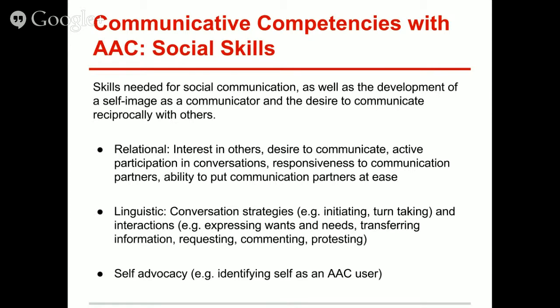Social competency skills are essential for communication with real people in real-life situations. Oftentimes, the social usage of AAC devices is not targeted because we think it will develop on its own, which is sadly not the case. Social skills using AAC need to be explicitly taught with a variety of partners focusing on same-age peers.